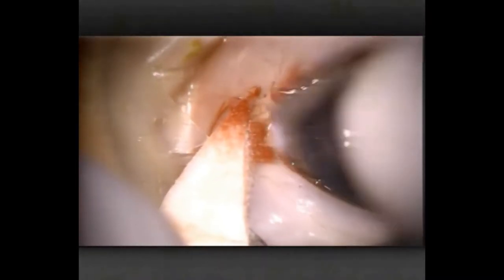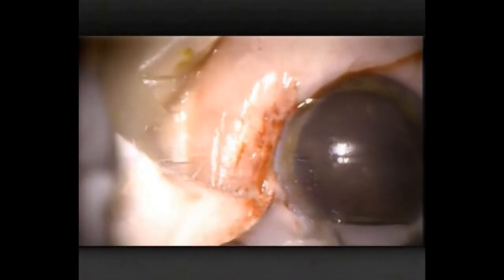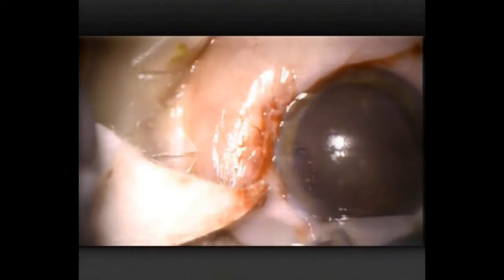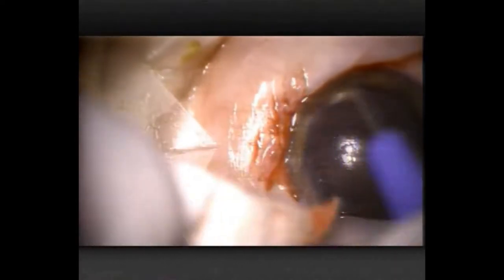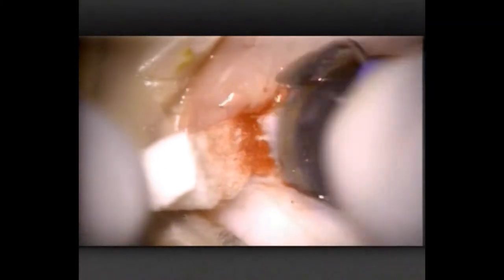You can see that I haven't done any cutting yet. I'm just doing scraping and pushing, and when I do pterygium surgery it's a lot of blunt dissection. I'm trying to find the original tissue planes.